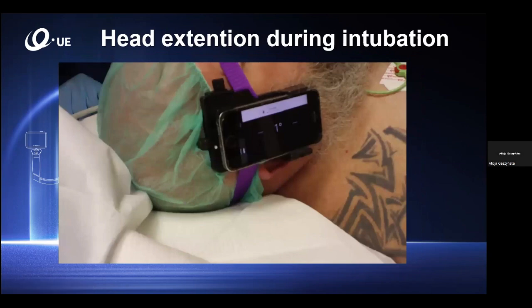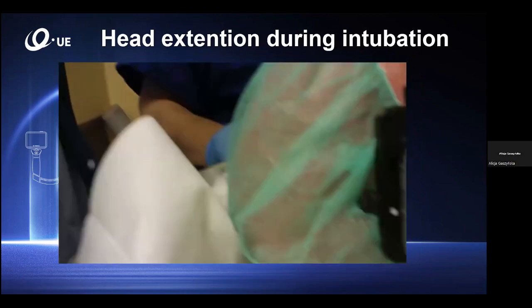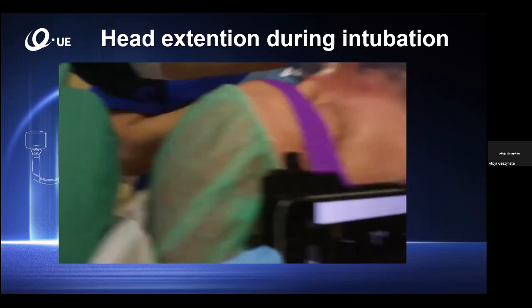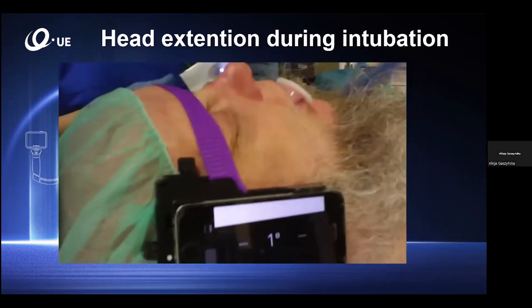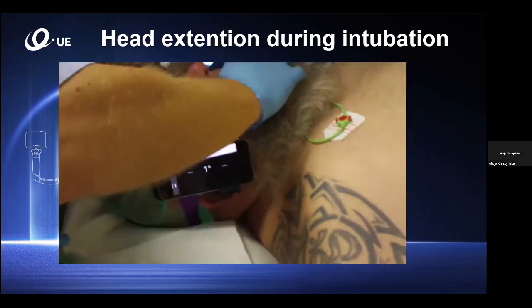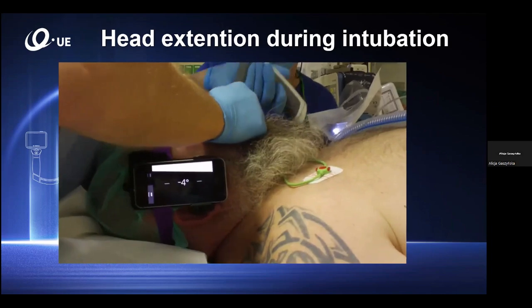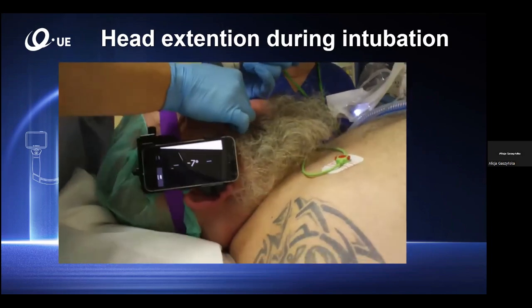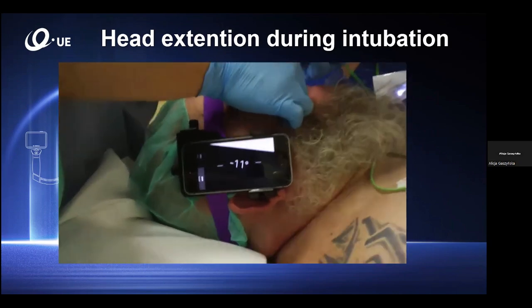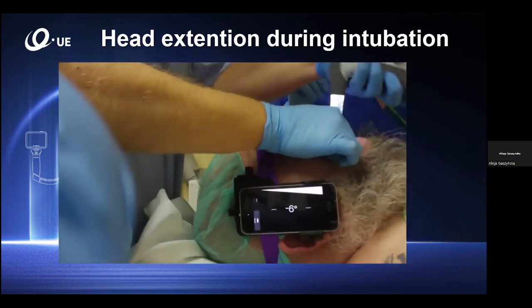And the last video that I would like to show you is, in my opinion, quite an interesting evaluation of head extension during the intubation efforts. In this patient, we decided to measure the head extension with a very simple device. As you can see, it's an iPhone with the measurement of the head extension. And this is a comparison with the direct vision laryngoscope. In this case, it's a V-scope, but it's direct vision, so you can say it's comparable to Macintosh. As you can see, the maximum head extension is 16 degrees.